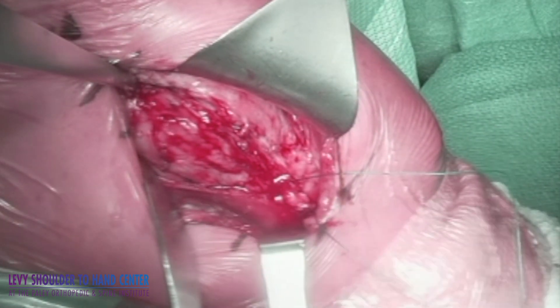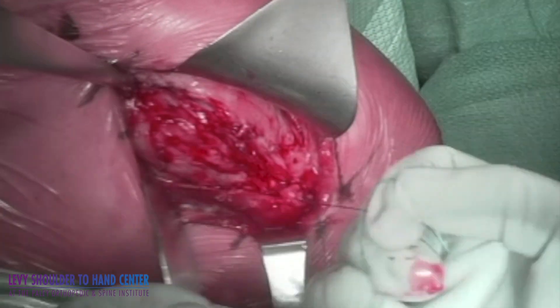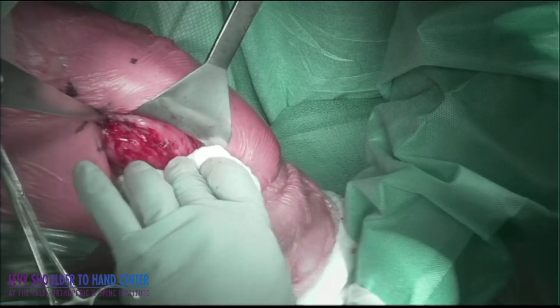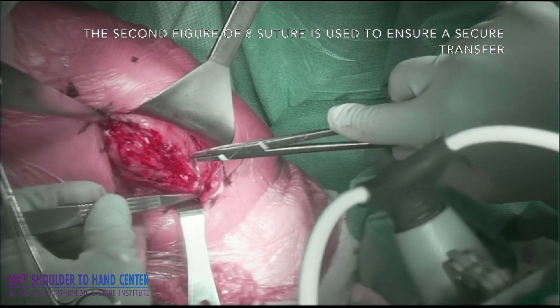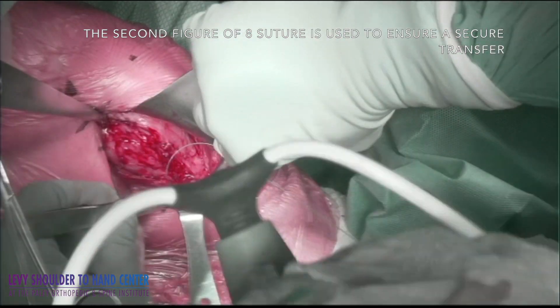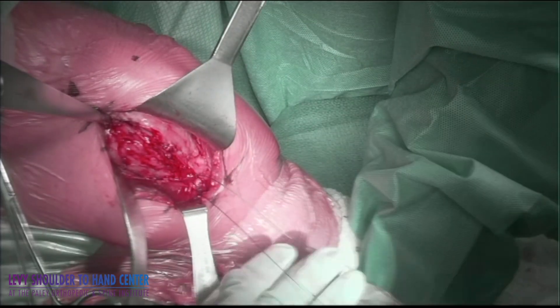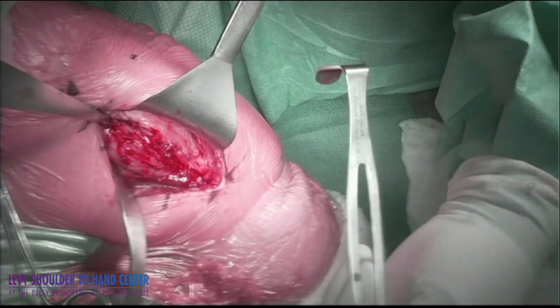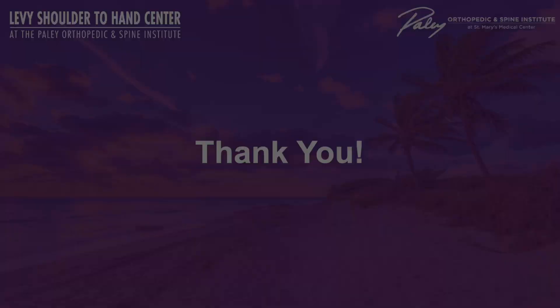The sandwich construct is: biceps, pectoralis major, biceps — transferring the biceps to the pectoralis major and utilizing two figure-of-eight sutures to secure the transfer. I typically use a number one Ethibond suture for this repair. There you can see the over-the-top biceps tendon transfer. Thank you very much.